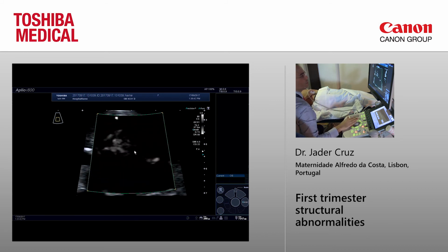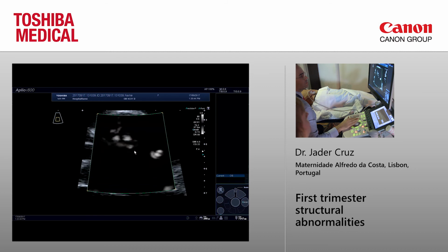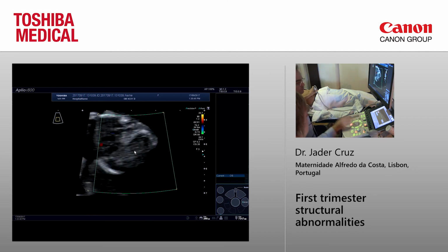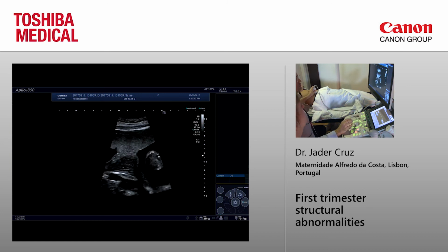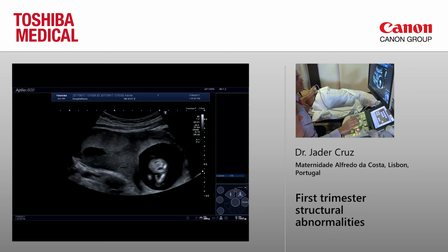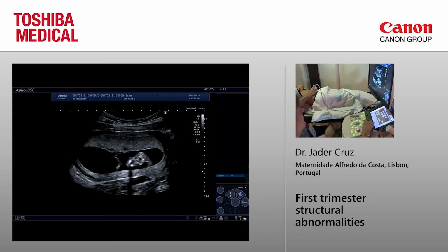Do you have any questions? Yeah. Any questions? While Dr. Cruz is still with the transducer on the baby, something you want to see specifically? No?